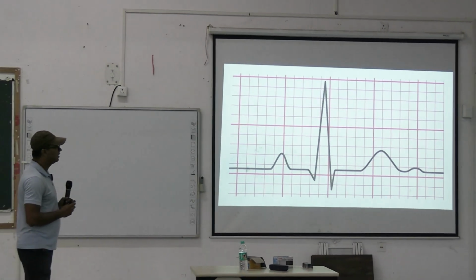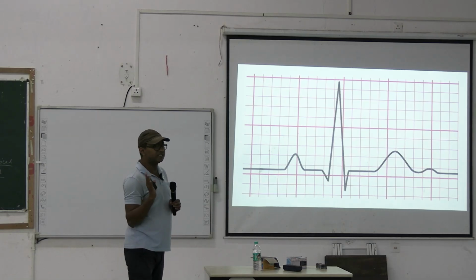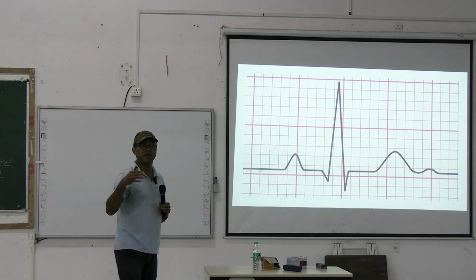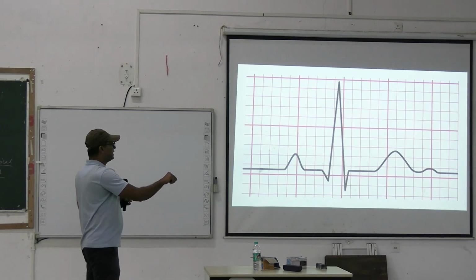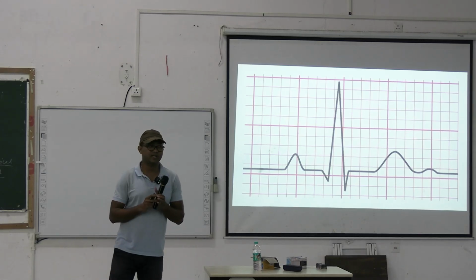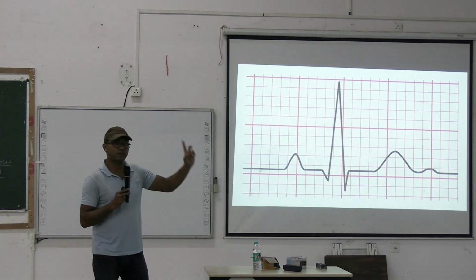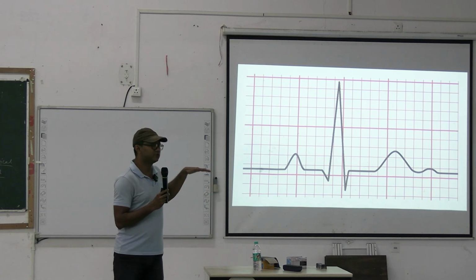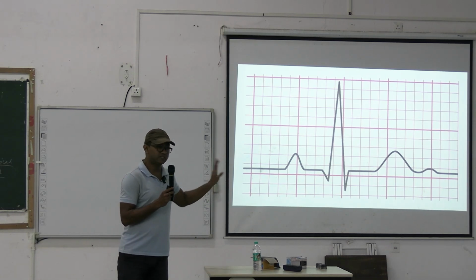So, is there any isoelectric line in the ECG, within the ECG after starting of P wave? P wave start howar pore kono isoelectric line ache? Yes, this one is isoelectric line. Okay, so that essentially means after starting of P wave shuru hone ke baad and before the ventricular complex, that is QRS complex, shuru hone se pehle, there is an isoelectric line. That means during that time there is no net voltage fluctuation.